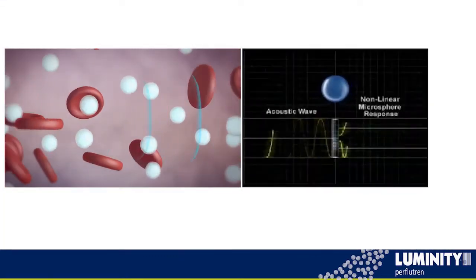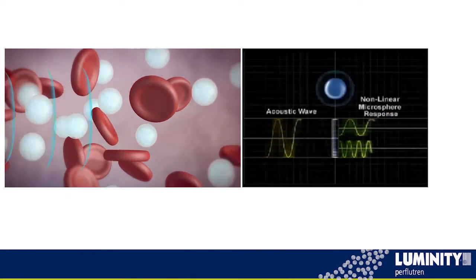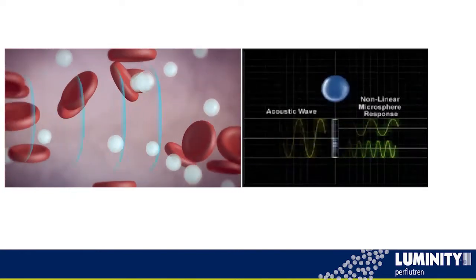Microbubble elasticity, or flexibility if you will, impacts how well a microbubble can respond or resonate due to the amount of pressure or power placed upon them, as well as how long a microbubble may resonate over a period of time before it cracks or dissipates. So a shell that is stiff can crack or break more easily, which impacts the imaging time. However, a shell that's more elastic or flexible, like Luminity, the greater its ability to be compressed and resonate to produce a nice and strong backscatter signal that we see with Luminity.